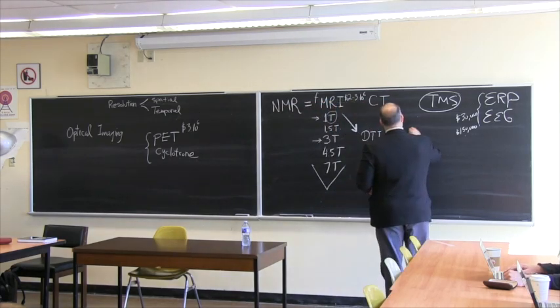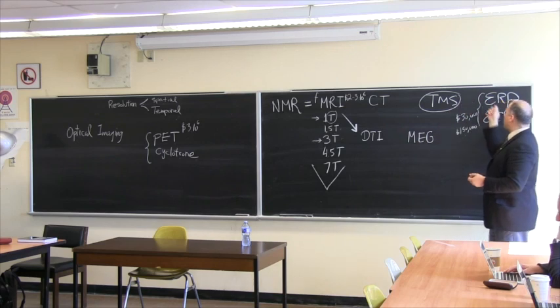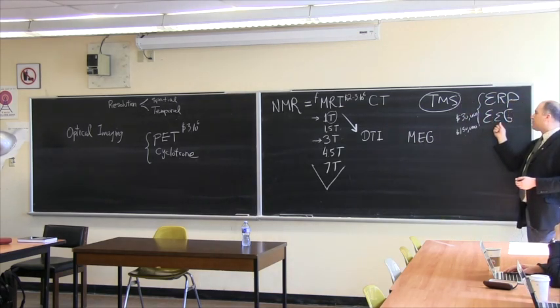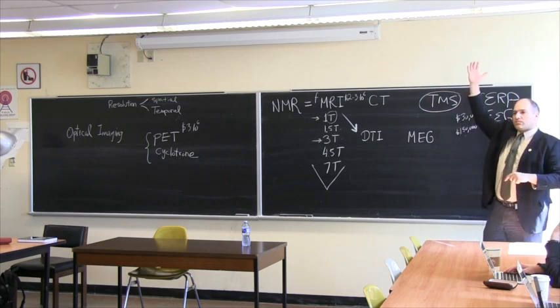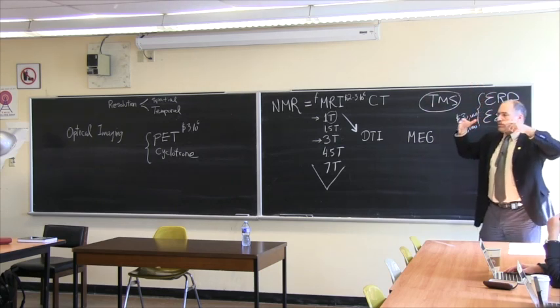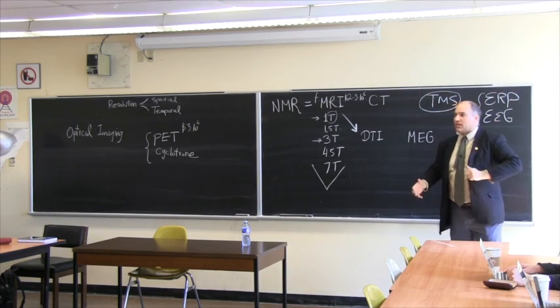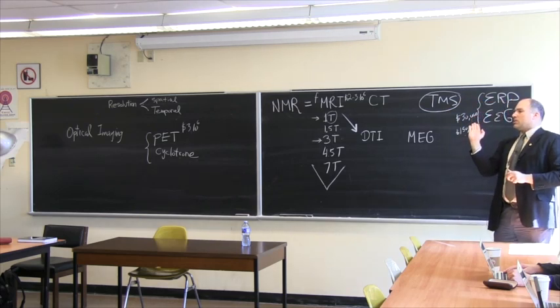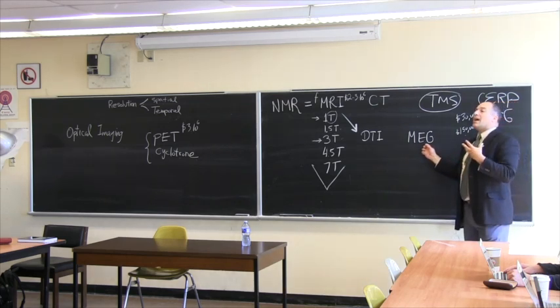We have another technique called MEG, that I'm going to show you here at the Neuro. MEG stands for magnetoencephalography, and it is actually like the magnetic mirror image of ERP and EEG. It looks like a machine from outer space, because you go into this chair, and there's like a whole house built on your head, which contains all kinds of sensors. The chair can be either upright, or you can be a little bit reclined. The interesting thing about MEG is that it's listening not to the electrical activity in your brain, but to your actual magnetic activity. So it's measuring the magnetic field.